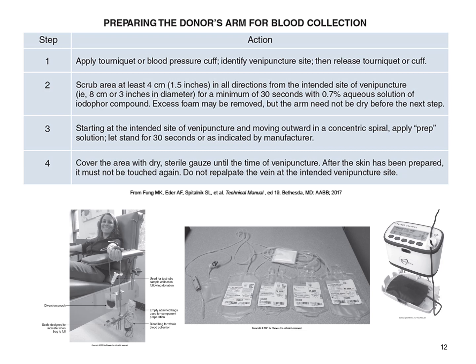Now, the unit bag itself looks a little different, and I'm going to try to explain it to you. There are different collection sets, but in this particular set, you have the needle area, and then the bag will divide off into two directions, so you can see where it divides here. In this one direction, you have a little valve that you can clamp off, as well as one here that controls the flow.